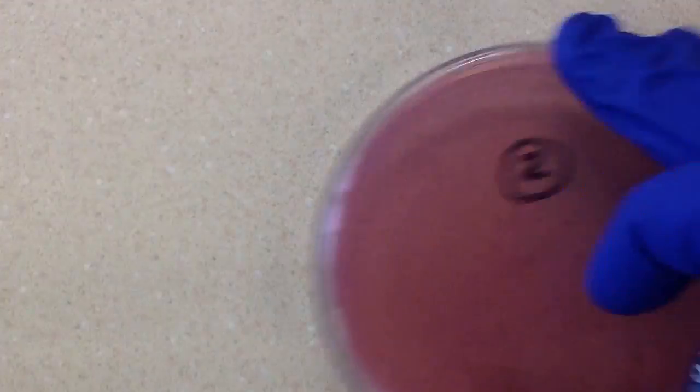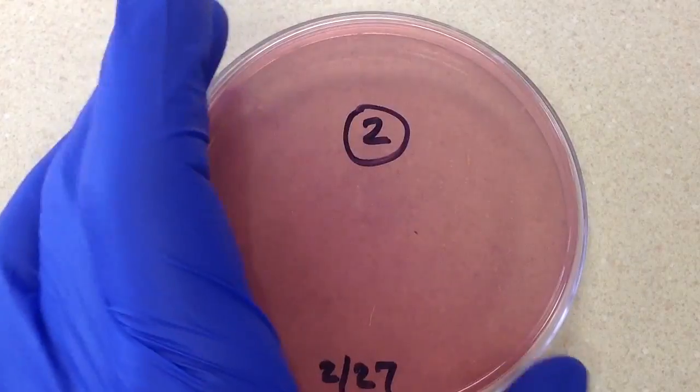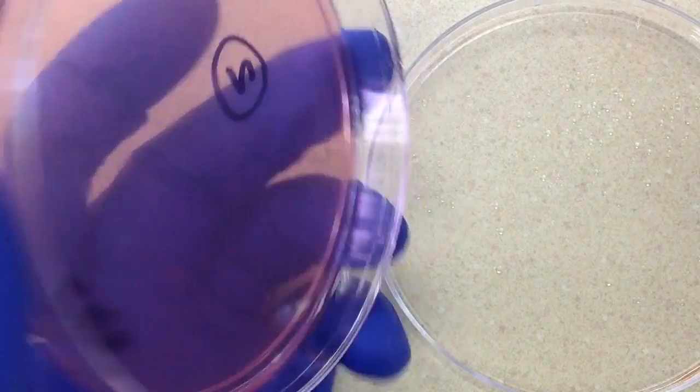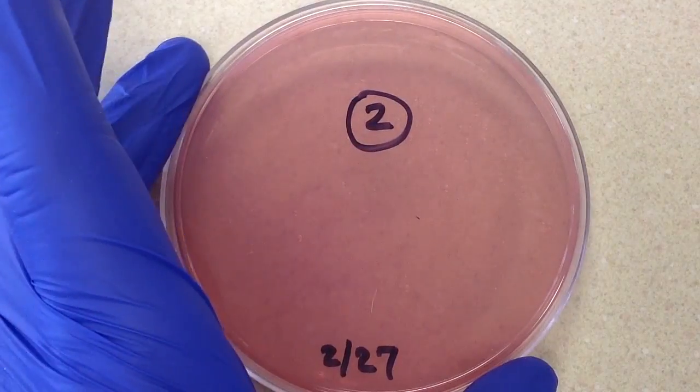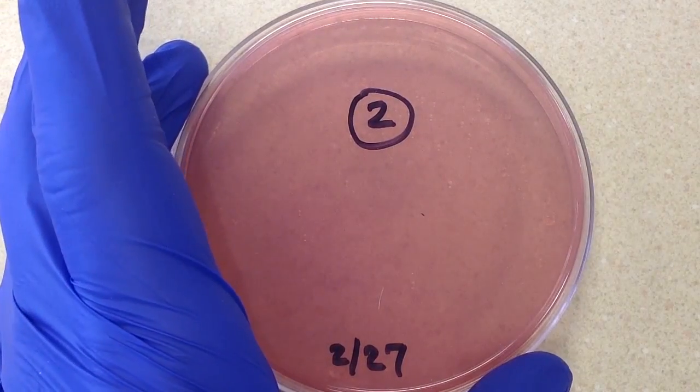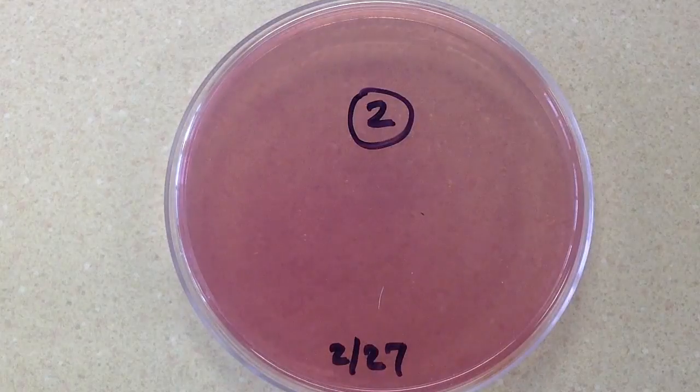Let's take a look at our last plate, our McConkey's. Our McConkey's shows no growth. The significance of that is it's telling us we are not dealing with any kind of gram-negative rods — the bigger, healthier gram-negative rods like members of Enterobacteriaceae or Pseudomonas, as opposed to more fastidious gram-negative rods like Haemophilus.